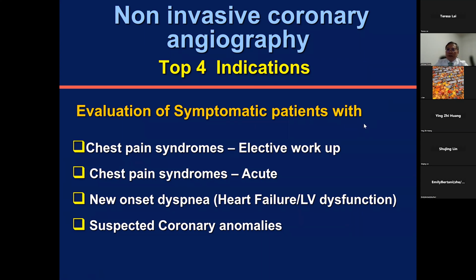So for non-invasive coronary angiography, the four top indications are evaluation of chest pain, either elective or acute, and the evaluation of shortness of breath, which is a very common symptom we see in the cardiology office. And lastly, suspected coronary anomaly.